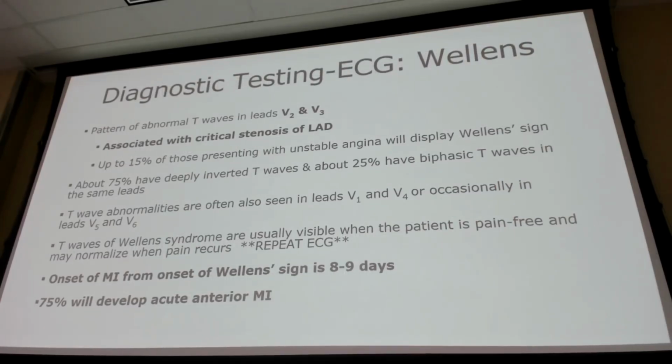And then we're going to move into Wellens syndrome. So this isn't considered a STEMI, but it has a very high risk for a STEMI in the next 8 to 9 days on here. Really, we quantify in like the next 30 days, they have an extremely high risk.